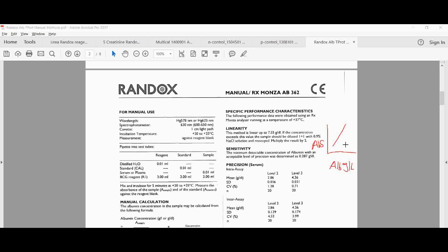Now you only did that for a limited number of concentrations, but if you went higher, you will find that this result might curve somewhat. It might go that way, or you might get results that are very high there, very high there, and so you go on.